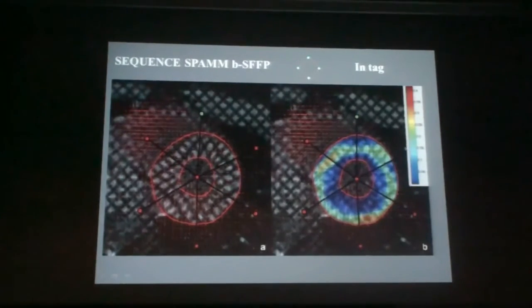Thank you. And what you have then, you do have squares over here, and you're going to analyze from these squares the modification of the distance between each of the squares that are represented in blue in every direction, so that at the end you can reconstruct strain images of your left ventricle on which you can add colors that will tell you which part of your left myocardium is correctly thickened or is not correctly thickened depending on its anatomical location. The disadvantage of this technique is that you do have a spatial resolution that is limited by the distance between each square, which is usually 5 millimeters.